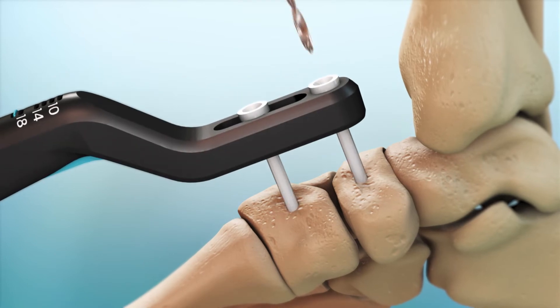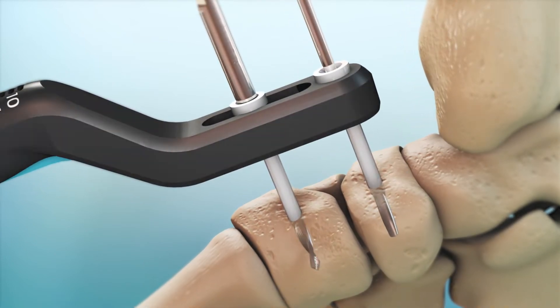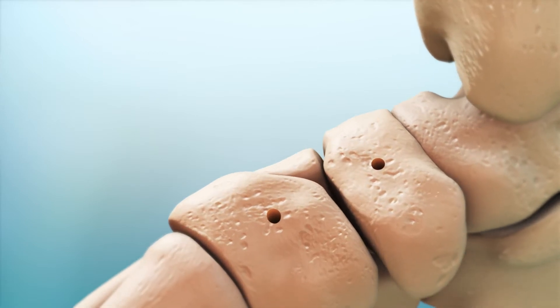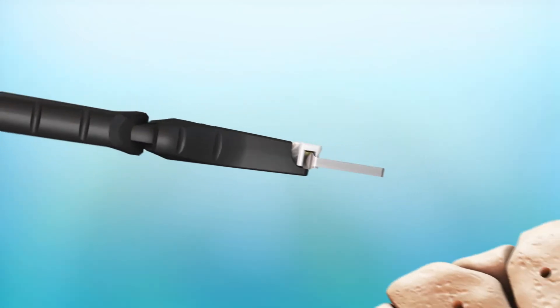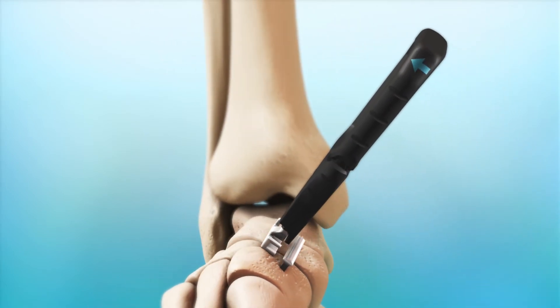To prepare for deployment, use the adjustable universal drill guide to drill two holes at the desired width. Place the legs of the Dynaclip into the pre-drilled holes, then release the inserter from the Dynaclip.